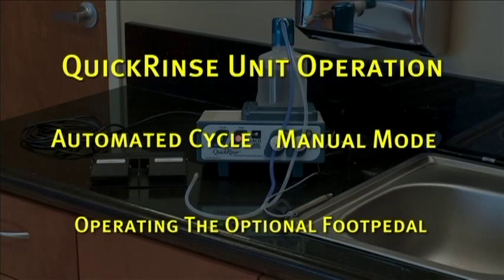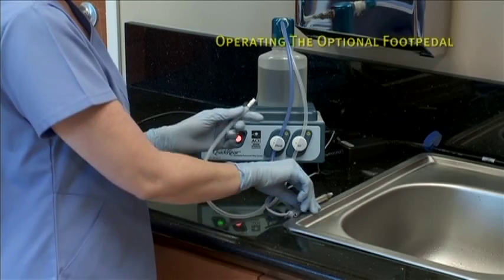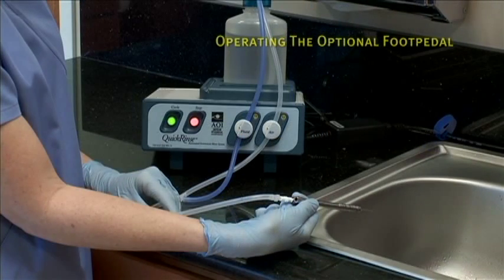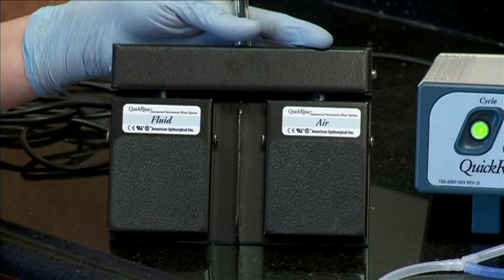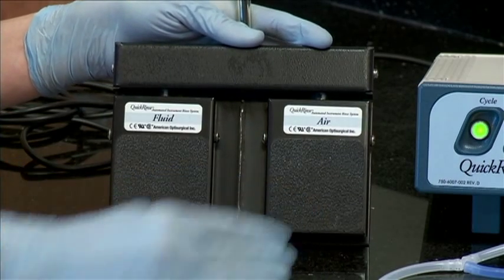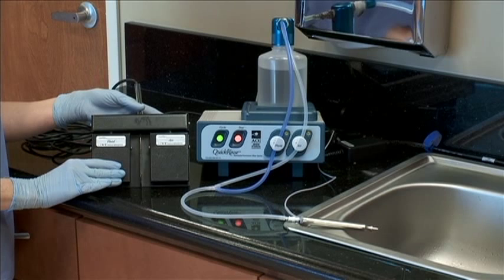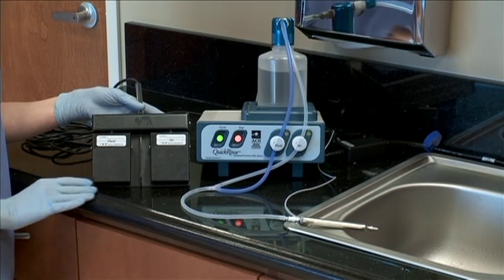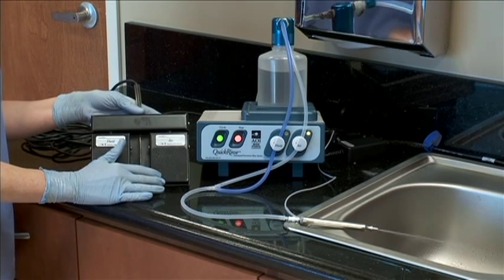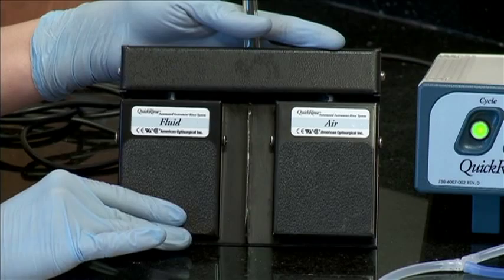This final section of unit operation is to show the use of the optional foot pedal accessory. Similar to the previous modes, first connect the instrument interface tube to the item to be rinsed. Make sure tubing is securely gripping the item to be rinsed. Before operating the Quick Rinse system with the optional foot pedal accessory, notice that the foot pedal is comprised of two foot switches. The left hand switch controls the fluid valve and the right hand switch controls the air valve. To operate the Quick Rinse using the foot pedal, press and hold the desired foot pedal switch — either fluid or air. The pump will run and the appropriate valve will remain open as long as the foot switch is in the depressed position. You may alternate between fluid and air by pressing the appropriate foot switch. Release the switch to close the valve.